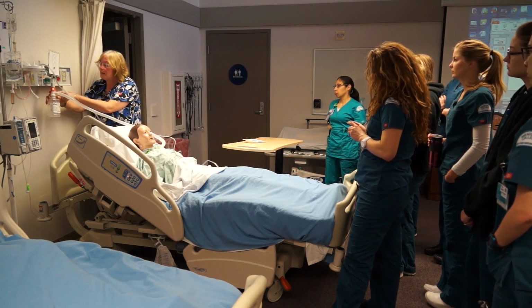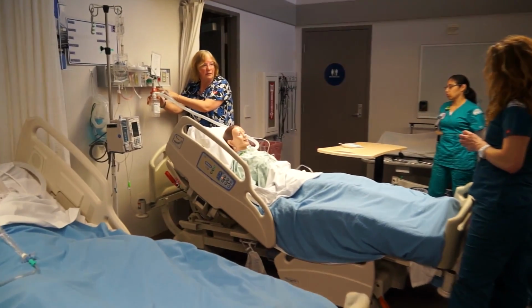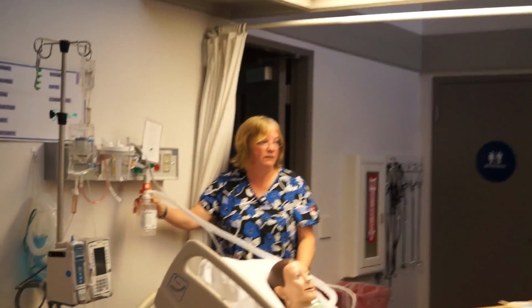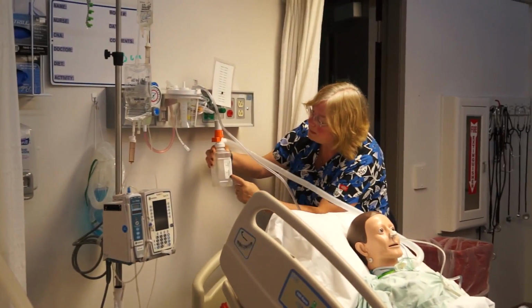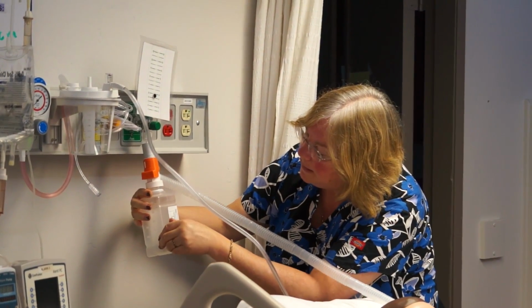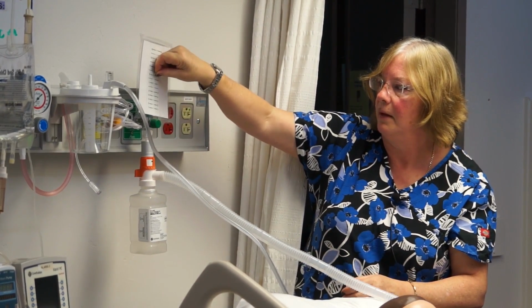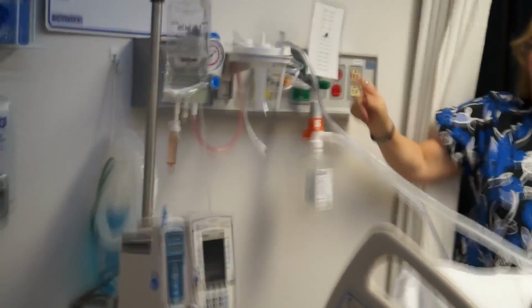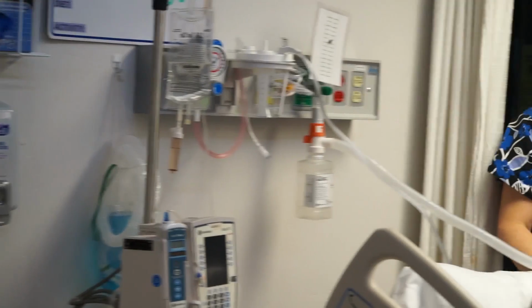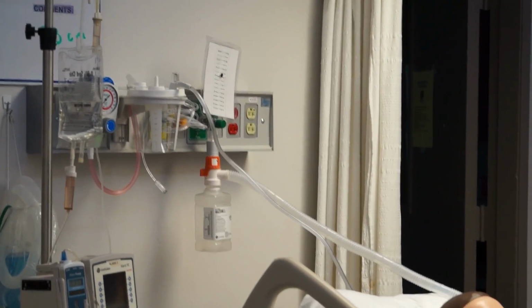My supplemental oxygen right now is set at 50%. It's dialed on here as requested by the physician. The flow is over here on the side. At 50% it tells me I need a liter flow between 8 and 12, so I'll put it at 9 liters. That will provide enough humidification that my patient will get moisture into his trachea and it will help thin his secretions out.